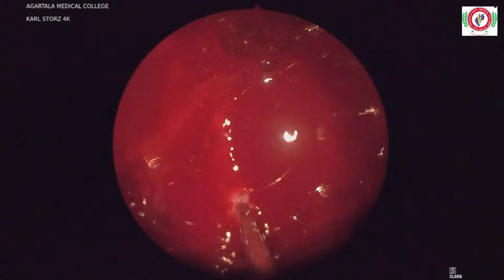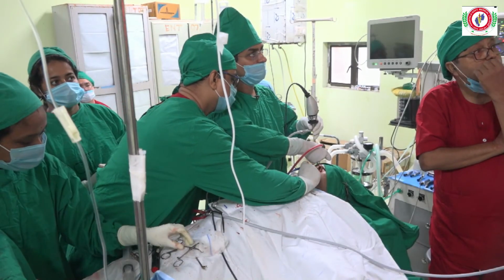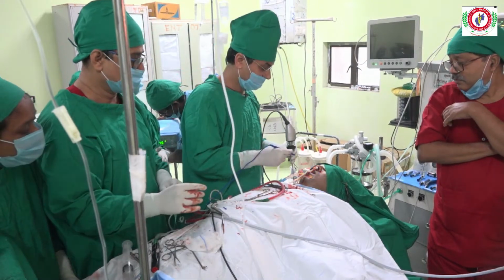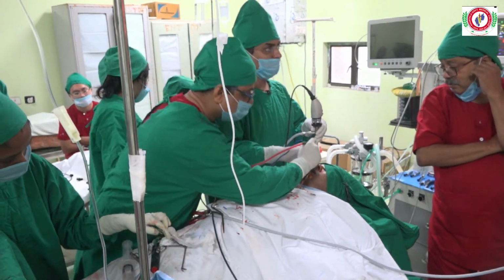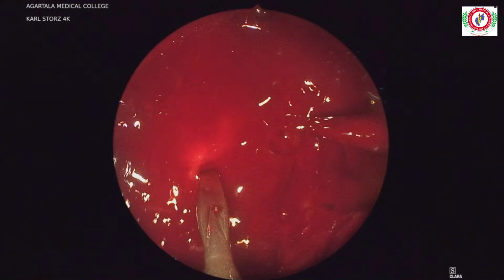Yes, now do it. Touch. Touch, yeah. It's not doing. Give me this. Yes, that's what I'll do. Can you put the suction inside now? Put the suction inside, yeah.